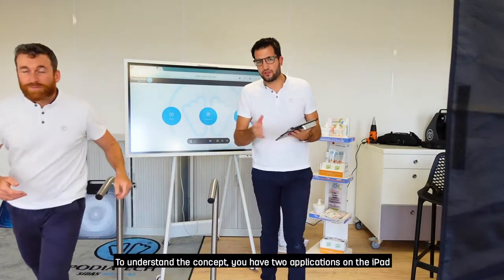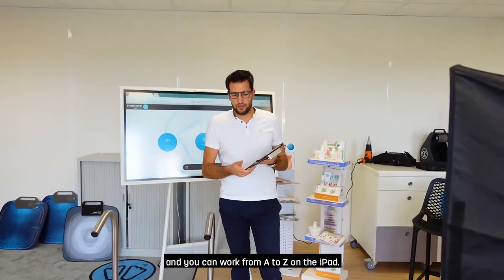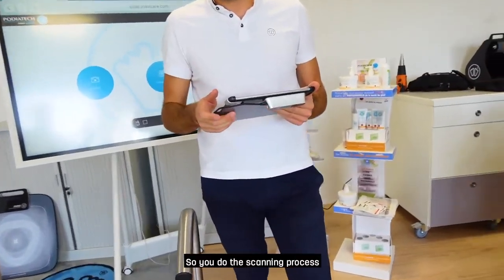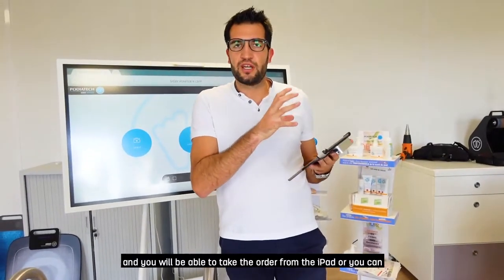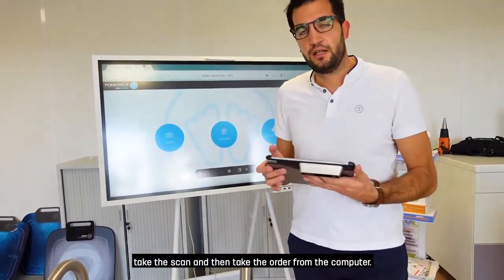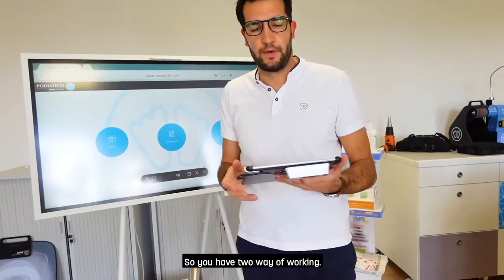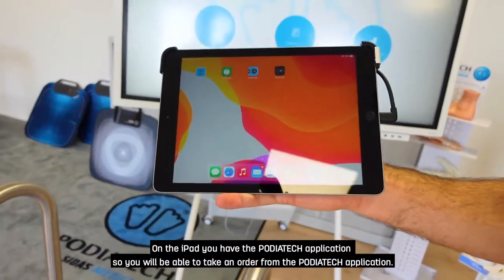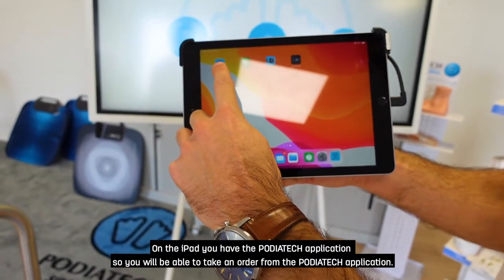Basically, to understand the concept, you have two applications on the iPad and you can work from A to Z on the iPad — you do the scanning process and you will be able to take the order from the iPad — or you can take the scan and then take the order from the computer. So you have two ways of working. On the iPad you have the Podiatek application, so you will be able to take an order from the Podiatek application.